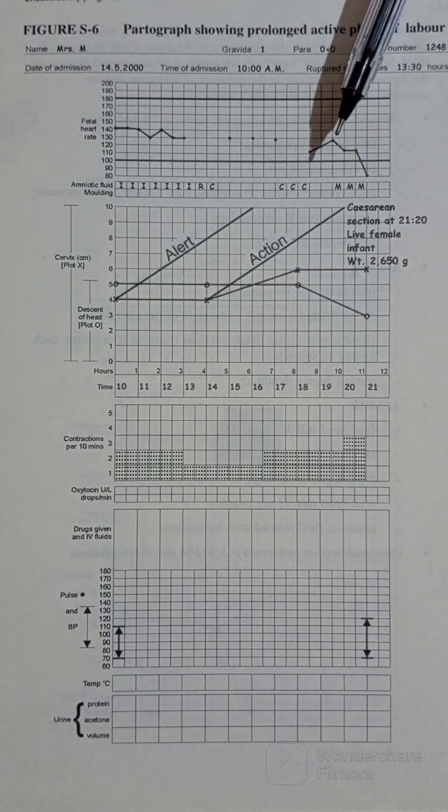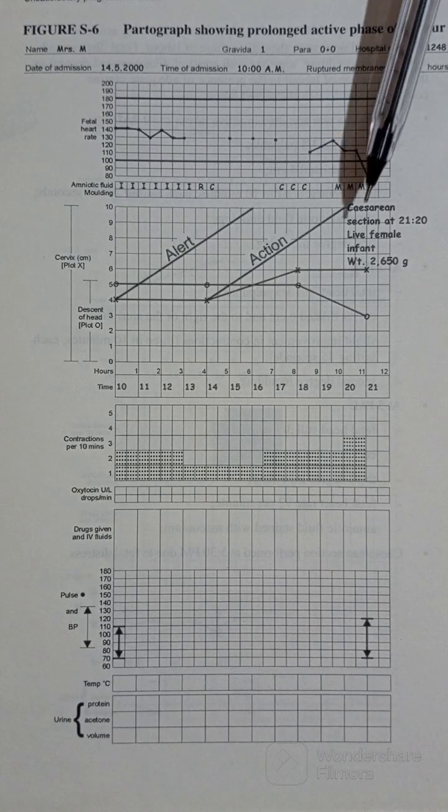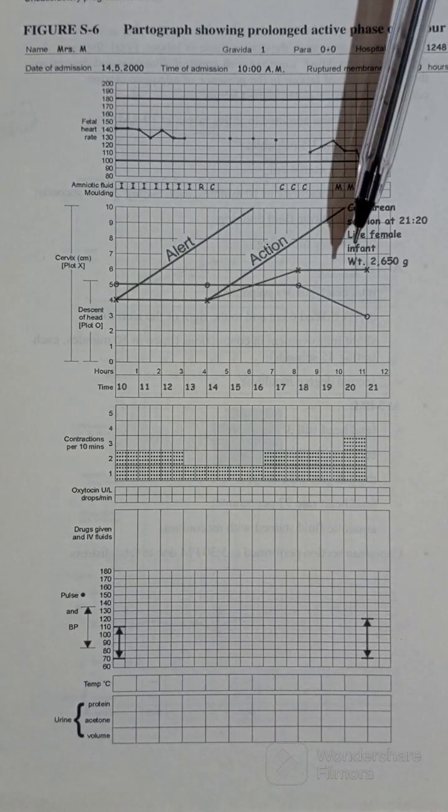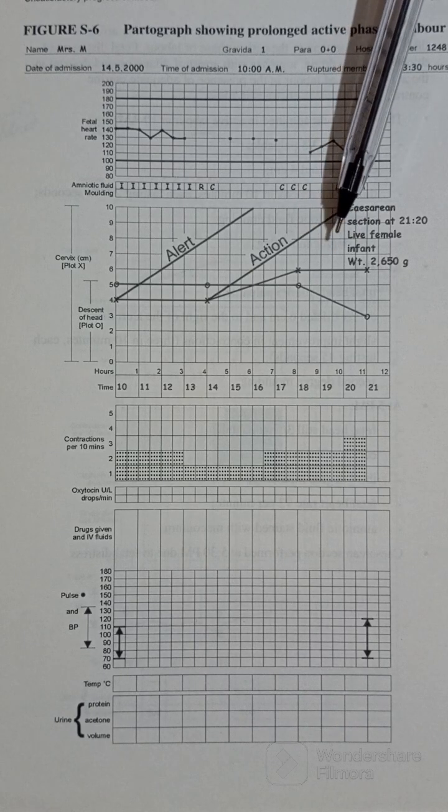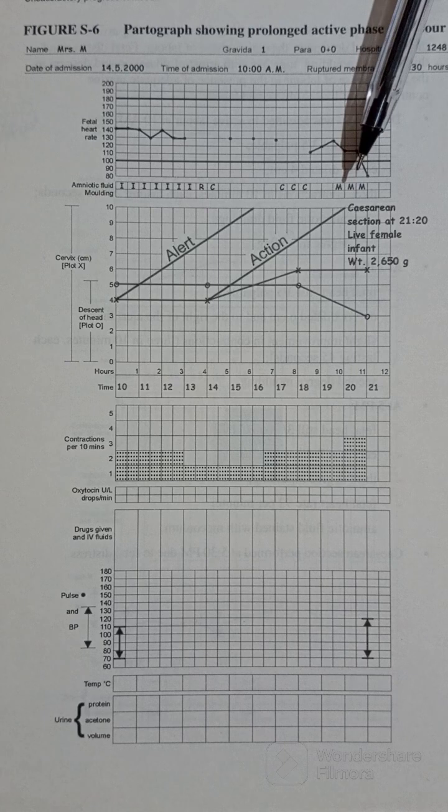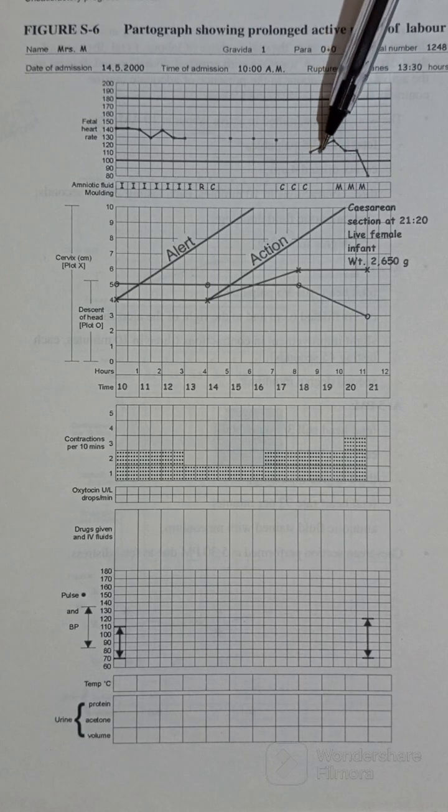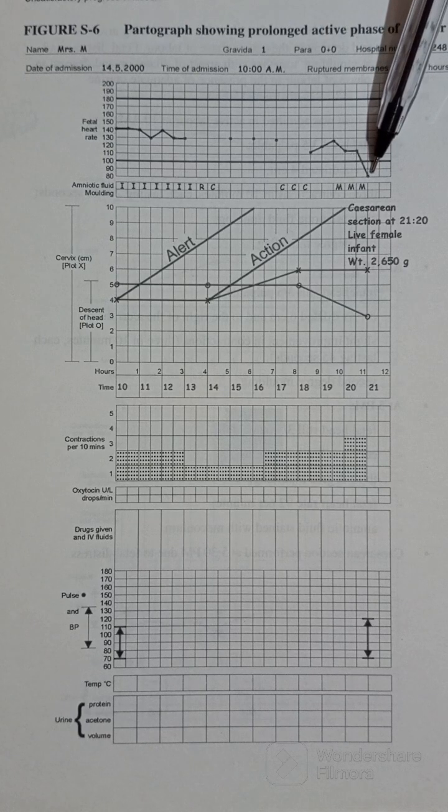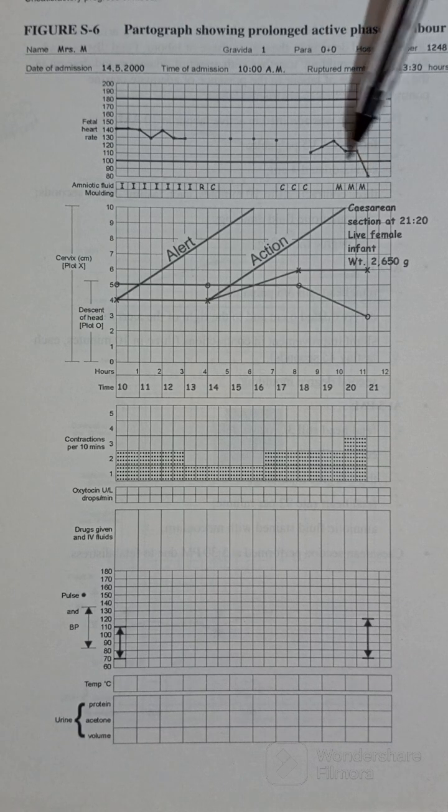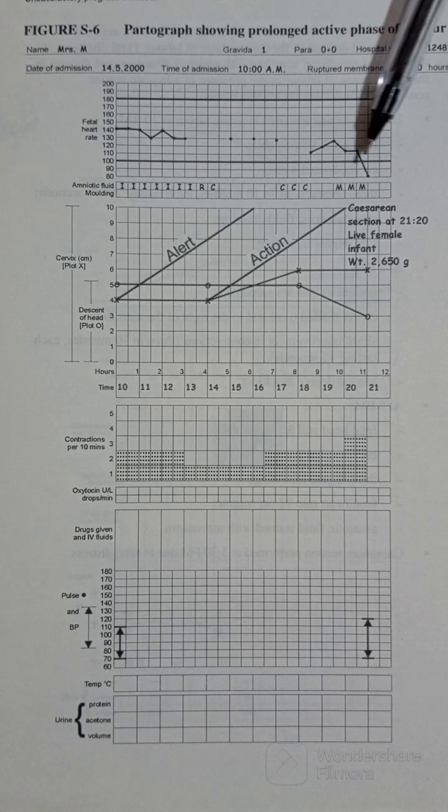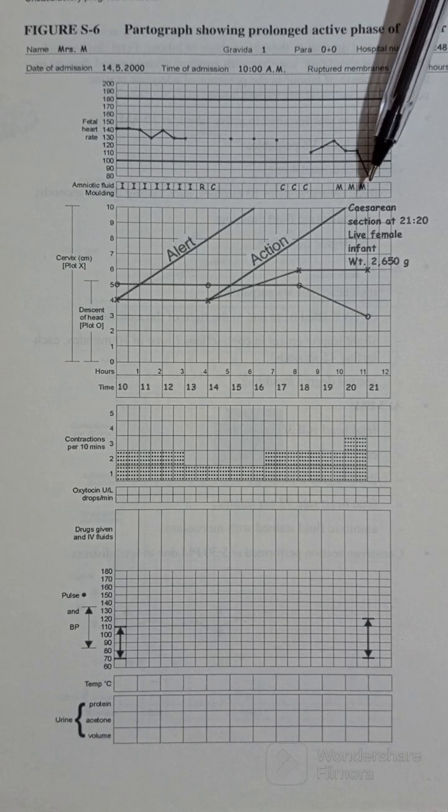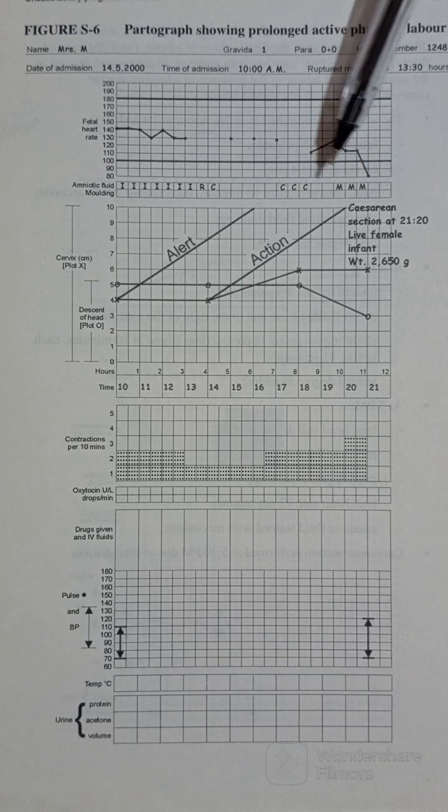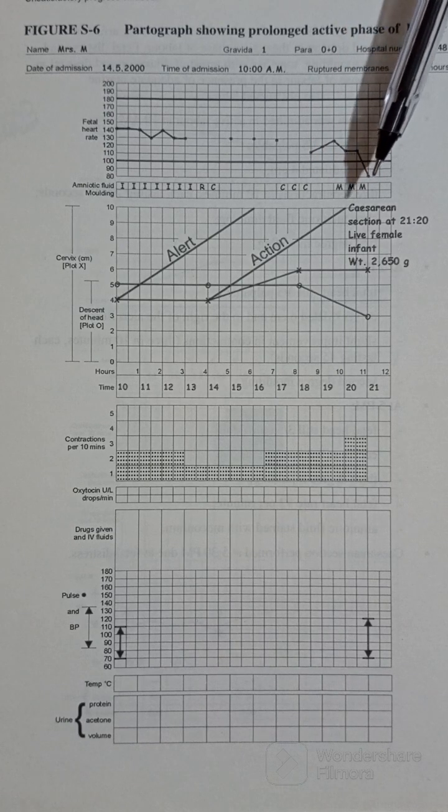Actually, obviously what prompted or what made them ask to perform a caesarean section, or to refer the client for a caesar, was because of the fetal heart rate that was dropping. You see the fetal heart rate went below 100 beats per minute. This is a dangerous sign.